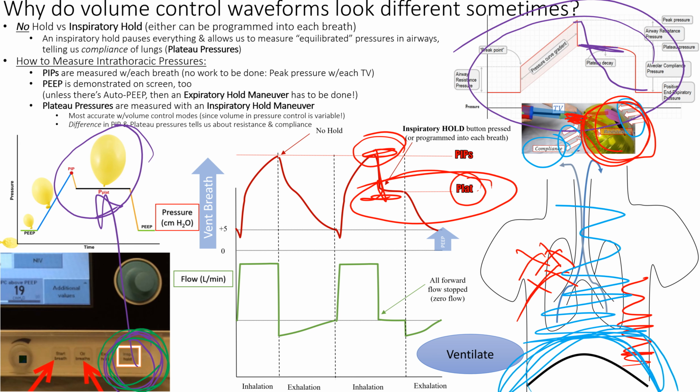Whereas if the plateau pressure was higher up here, a little higher, see this one's a little higher, the difference right there means there is a compliance issue. The magic number is like 5 to 10. So if it's a difference of 10 or more, the PIP versus plat, it's a bronchospasm or an upper airway issue. If it's less than 10, it's probably a compliance issue.